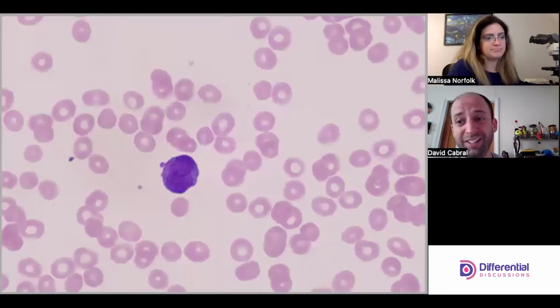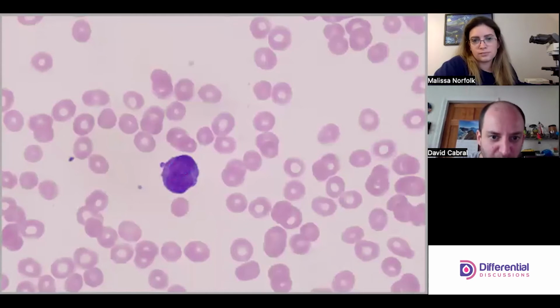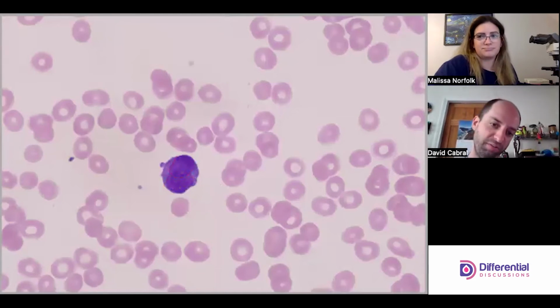It might be the cell. Yeah. And I think in general, these cells are staining a little bit darker, but I think I was just a hair too thick for us to be able to see the details. So this is a little bit better where you can actually see the line. Yeah, and actually what's interesting too, one of the ways that you can kind of tell that they're separate and distinct is because, what is this, a Venn diagram? Because you get this overlap like this, you end up with this darker area here. Yep. And that kind of gives you some kind of a three-dimensionality to what's going on.